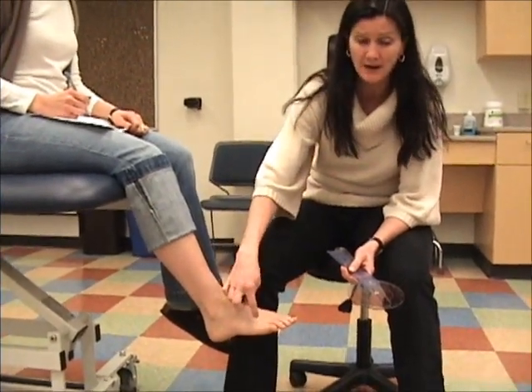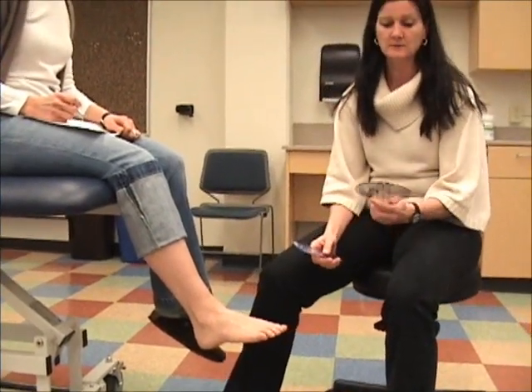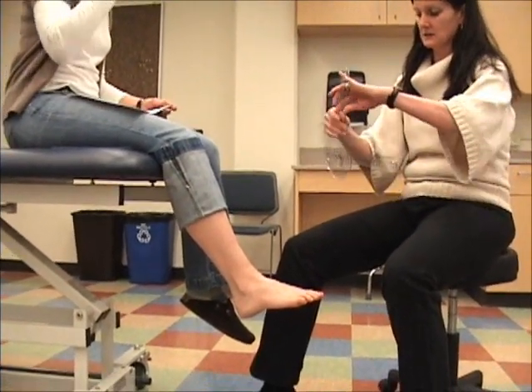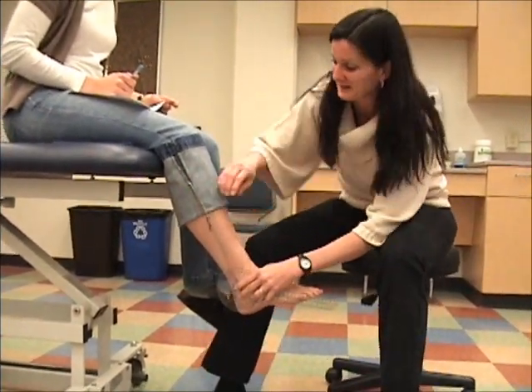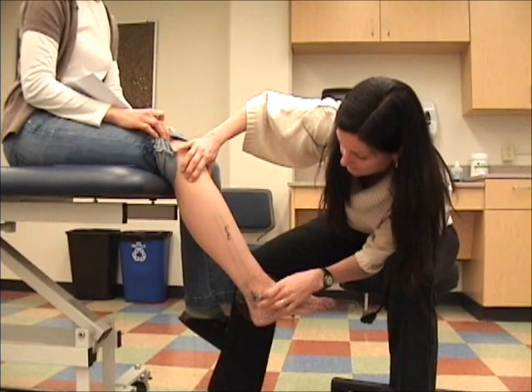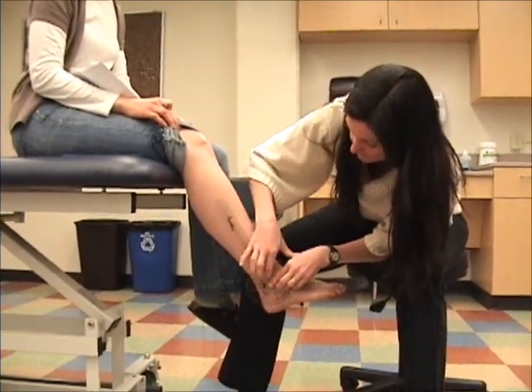The other arm is going to be parallel to the fifth metatarsal, and that's the challenge — you have to make sure that it's parallel. You really don't have an actual line to follow. So in this instance, I'm going to place my stationary arm. It's a little hard to show, but I'm going to slide that up as best I can to the head of the fibula, lining that up with the fibula.